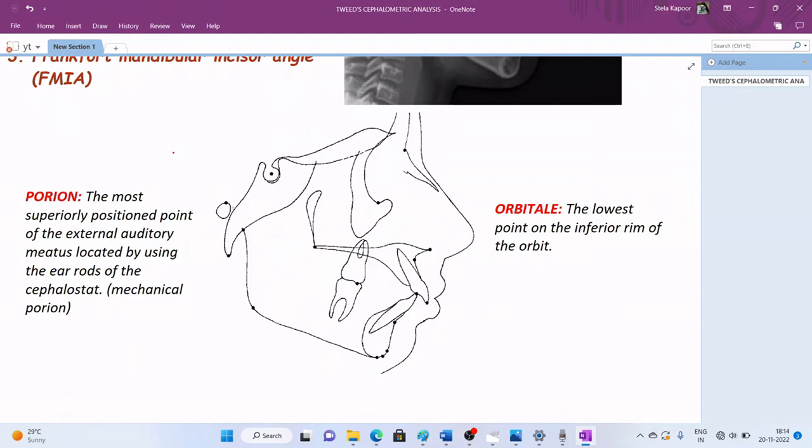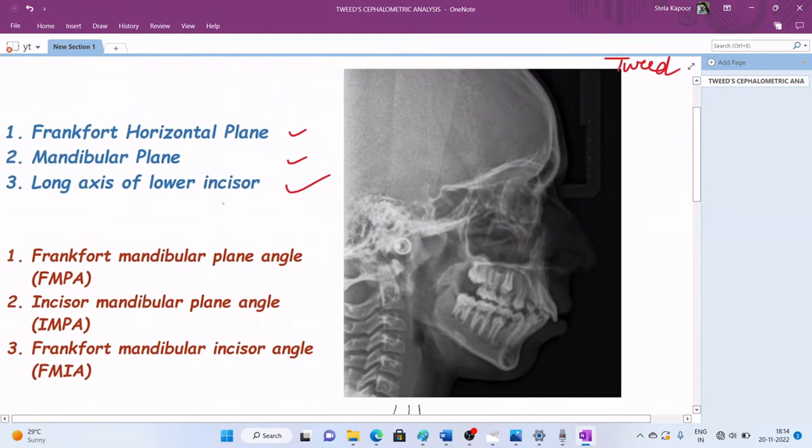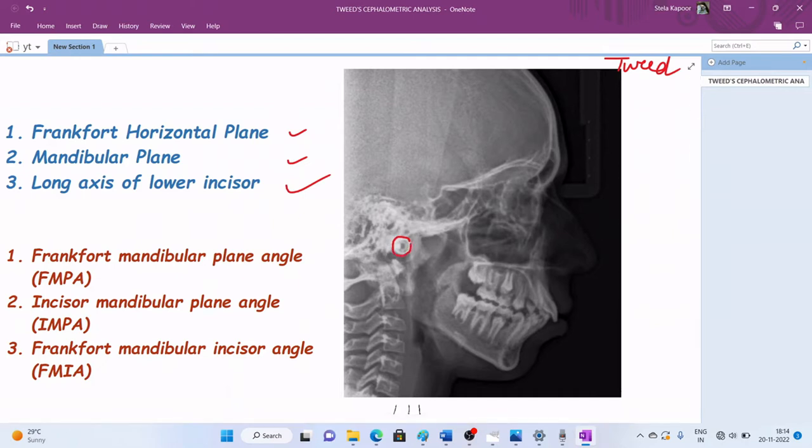Whenever we look at the cephalogram, we are able to make out the radiopaque ear rod, and the most superiorly positioned point on this is our porion. In this cephalogram, we can have a look at this radiopaque ear rod, and the most superior point is the porion.